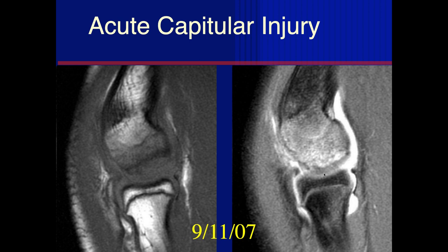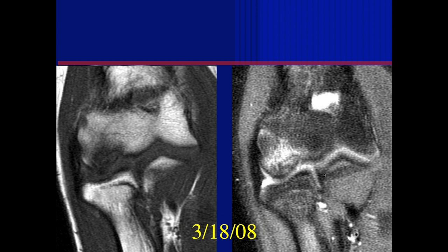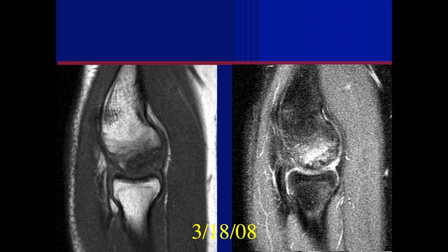The patient came back about 6 months later, and this is what it looked like. Michael? There's significantly decreased edema, but you can still see a fracture line, subchondral under the capitellum. It's still not that displaced. You could worry about a post-traumatic necrosis. What would you call this if you hadn't seen the first injury? I'd call this a subchondral fracture. Could it look like Panner's disease or something? Yeah, depending upon the age, this would be Panner. Yeah, this is a subacute impacted fracture of the capitellum.